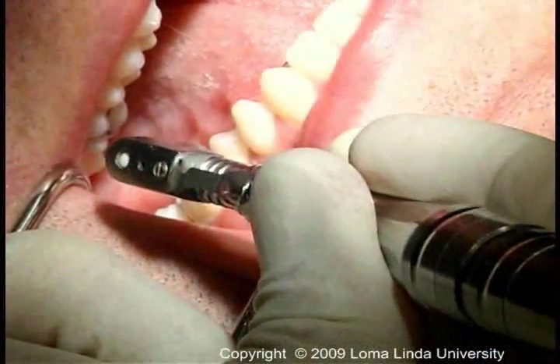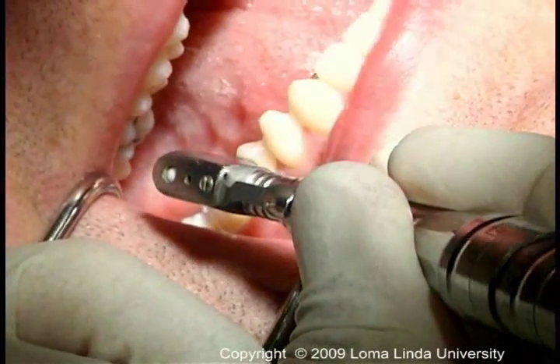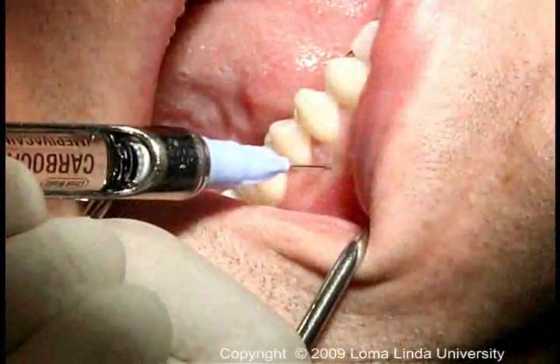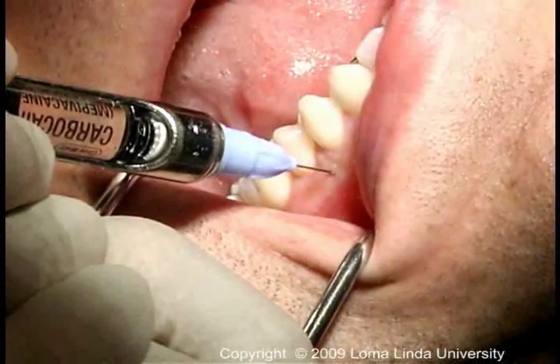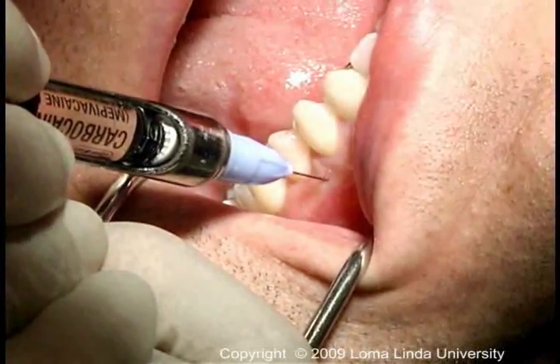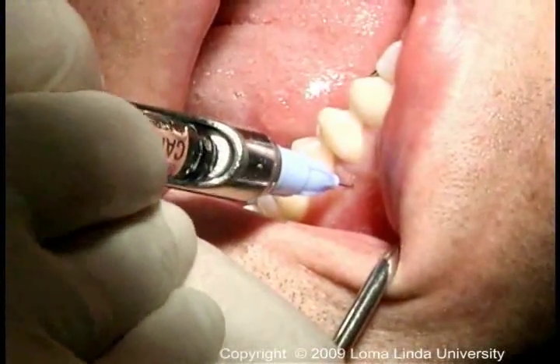The perforator has been replaced, and this alternate pressure is continued until the perforator drops through the cortical plate and into the medullary bone. The needle must be positioned exactly in the same spot and in the same orientation as the perforator. Otherwise, it will not penetrate and be in proper position. Some maneuvering is often required.